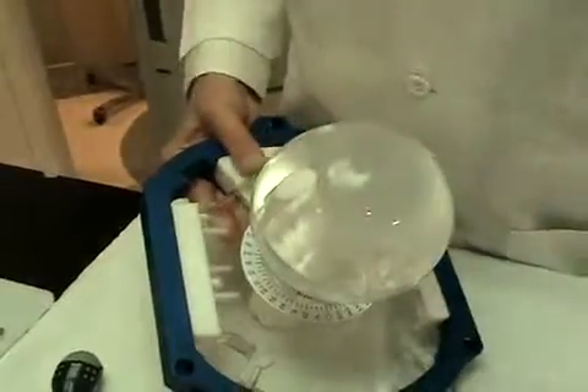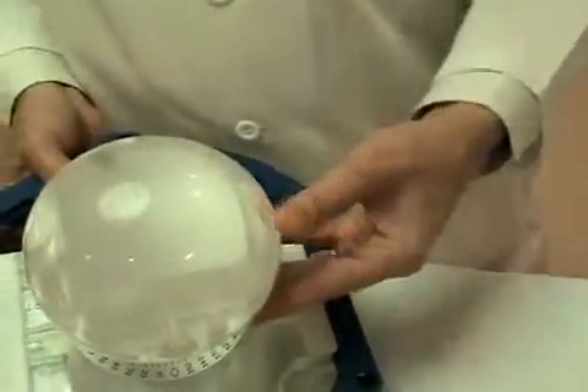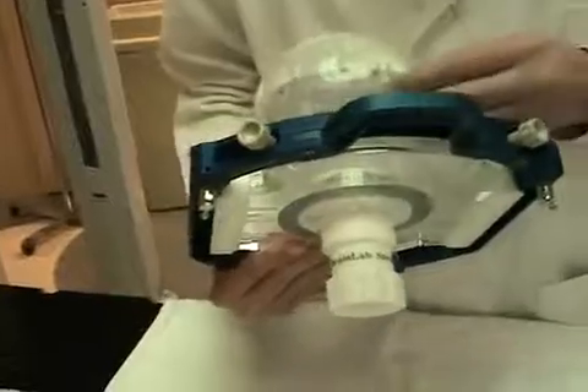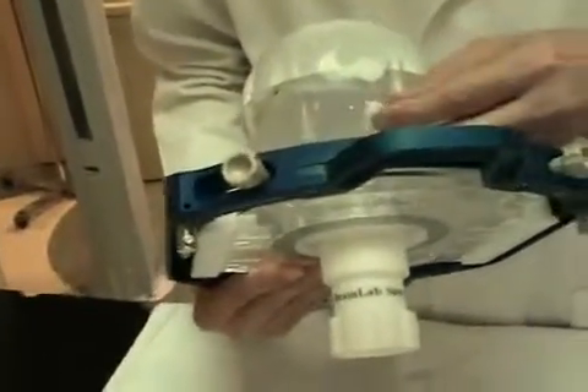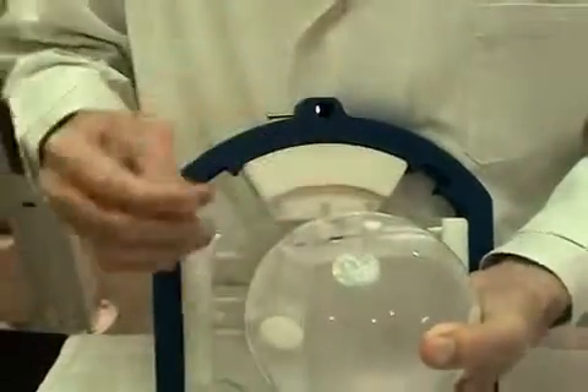These nylon plugs are beveled to fit the contour of the surface of the sphere. Sometimes the plugs fall out.